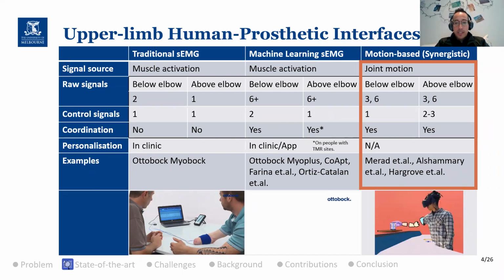People have looked at it with different approaches and methods, like linear coupling. Some people have obviously looked at machine learning methods, using neural networks and this sort of thing. But people haven't really looked at personalization. In the other methods, the clinician would tune the sensors so the person can use the interface effectively.